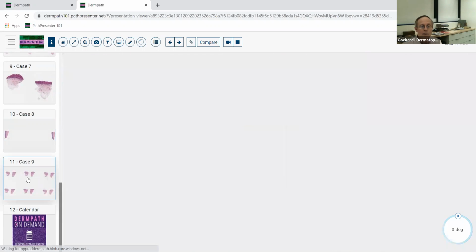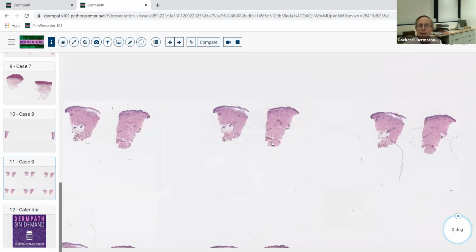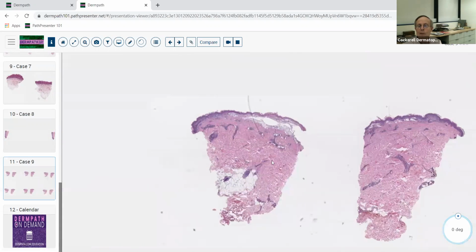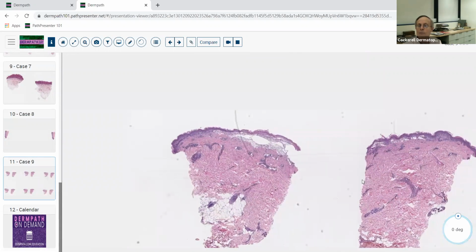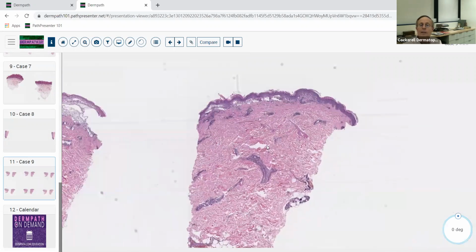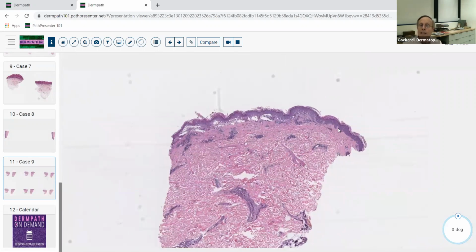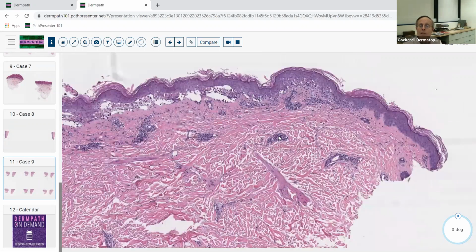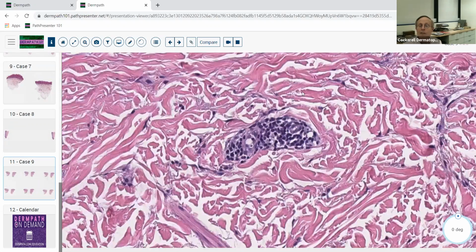Okay, so let's take a look at one more today. And this is a good example because we're talking about chronology here. Remember, we talked about chronology in the introductory lecture, and we just mentioned it in the erythema multiforme. So once again, we've got a vacuolar interface dermatitis with a relatively limited amount of involvement of the dermis, perivascular lymphocytes. Again, these are going to be jet black dark cells here. So we see lymphocytes only.